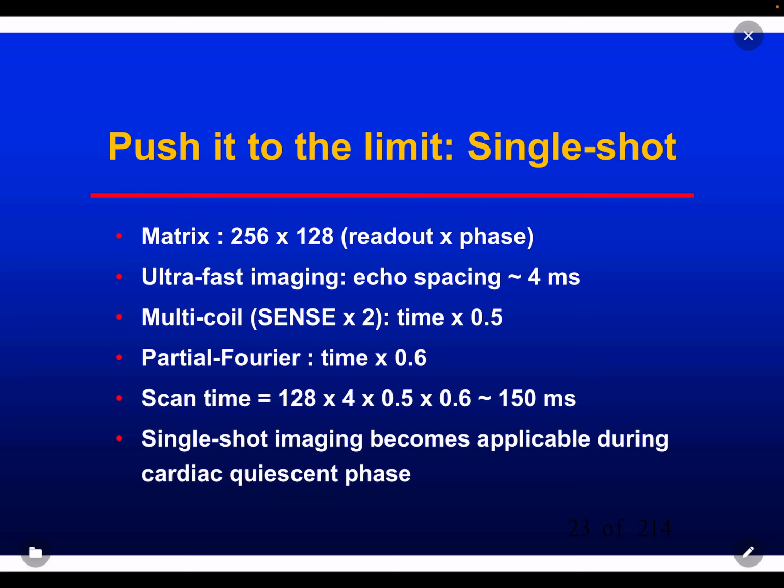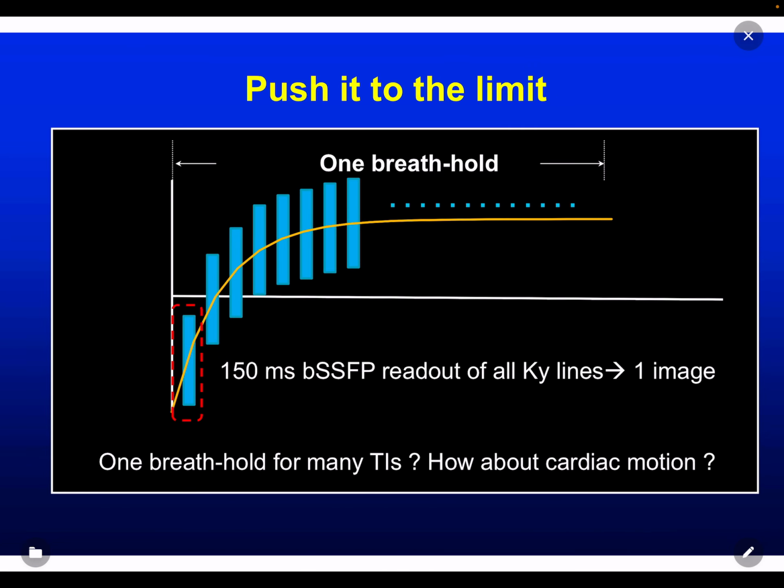So single-shot imaging becomes applicable during the cardiac quiescent phase. So we can use one breath-hold with the balanced SSFP readout to collect the whole inversion recovery curve.